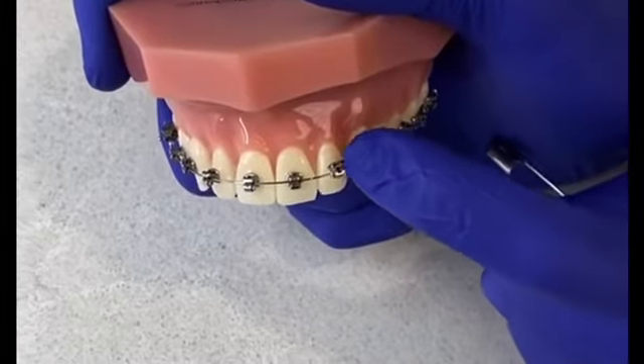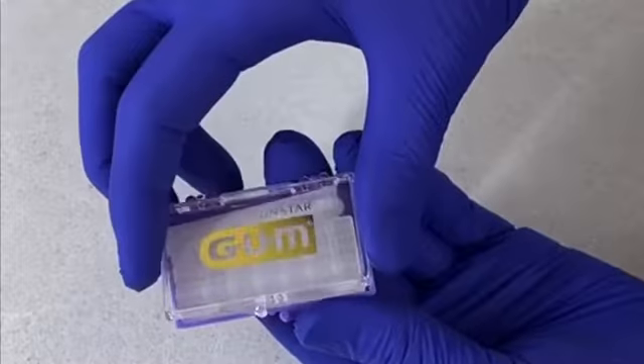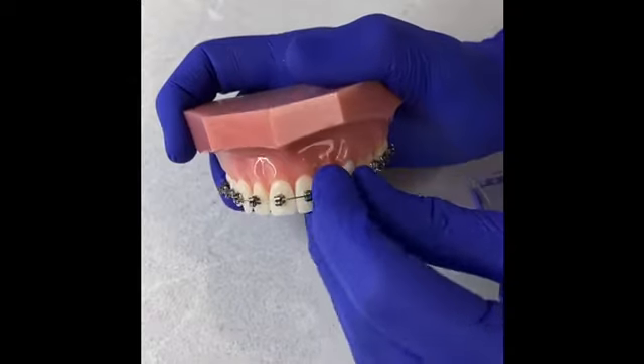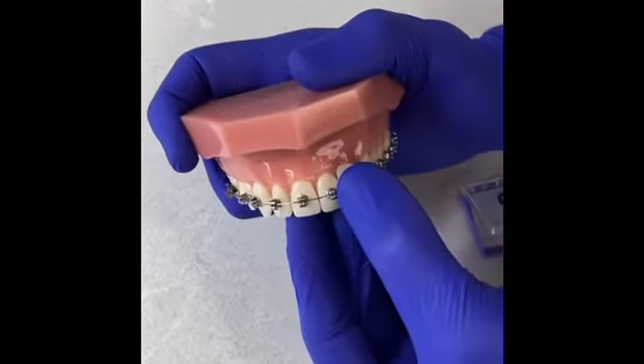If you notice that a front bracket is sliding on the wire, that means it's come loose off of your tooth. You can take a piece of wax and engage the bracket and the wire to securely hold it in place.